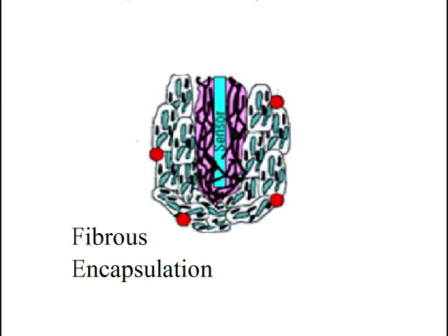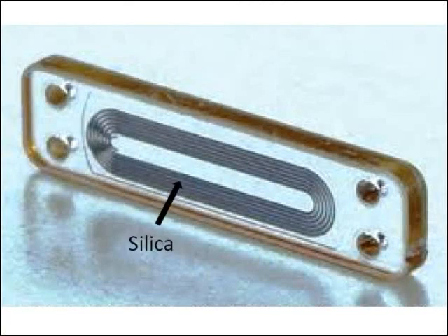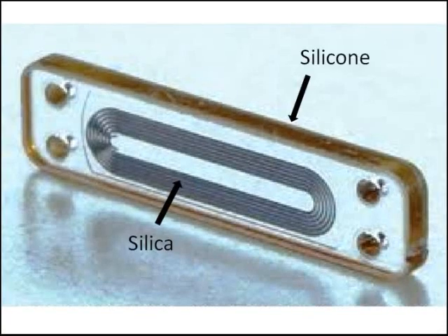Success of these implantable sensors also hinges on the device's ability to function for long periods of time inside the body. The foreign body response causes proteins and cells to adhere, eventually leading to fibrous encapsulation of the sensor, preventing the device from detecting pressure changes. While the PTFE coating helps prevent biofouling, all MEMS components still must be hermetically sealed in the fused silica housing with a silicone coating. This ensures that the device will function reliably throughout its lifetime.